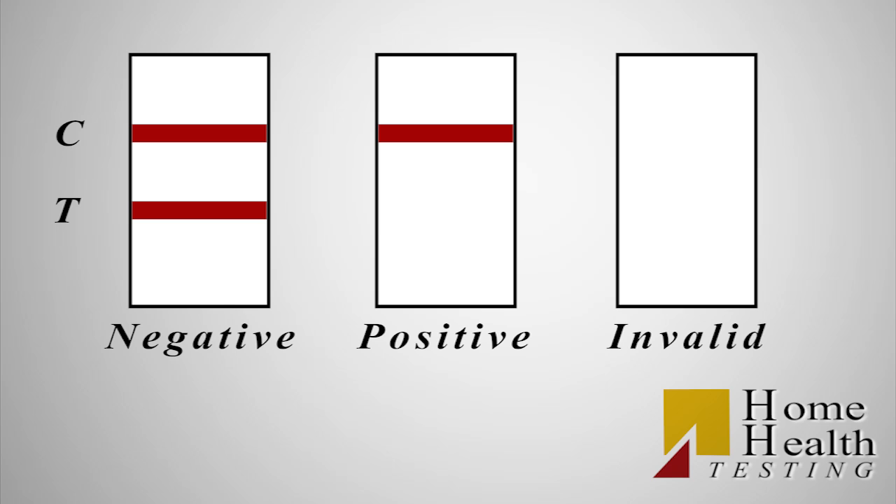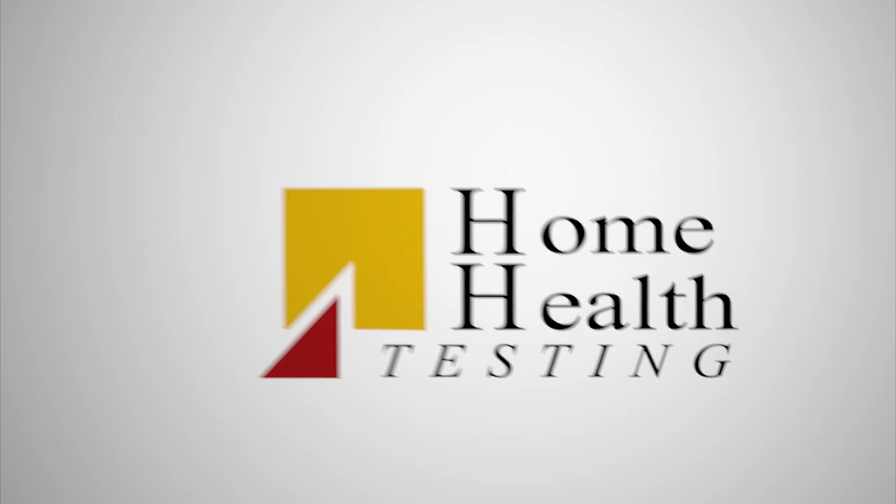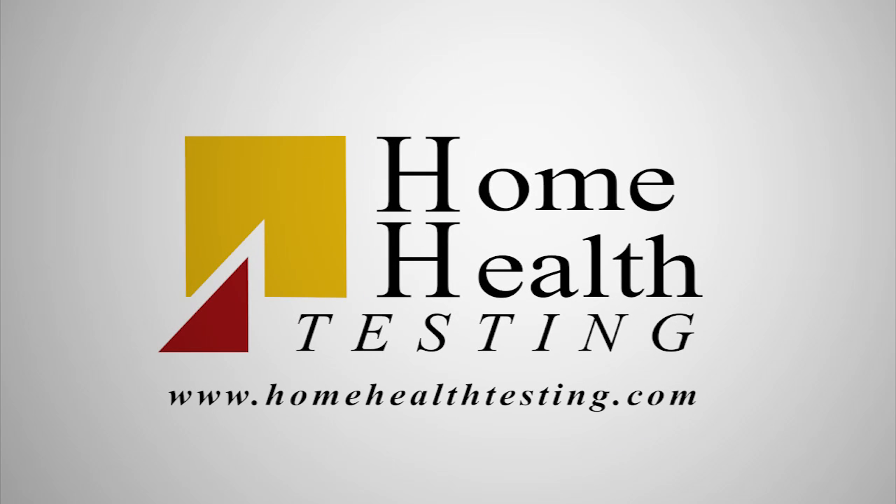If the test is invalid, no lines will appear. If you need more information or have questions, you can always get in touch with us at www.homehealthtesting.com.